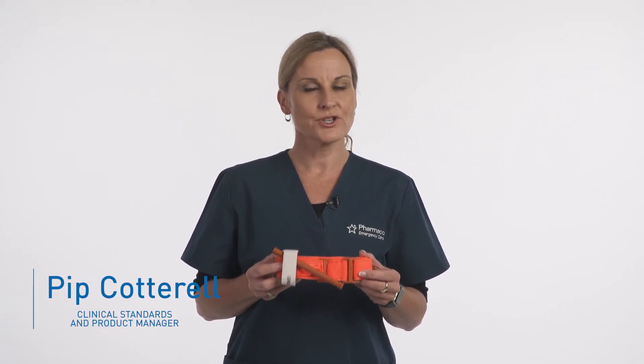We're talking today about the CAT tourniquet. I'm going to show you how to apply it to your own arm.